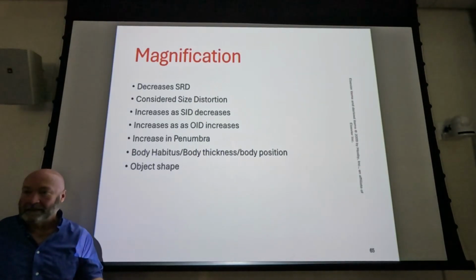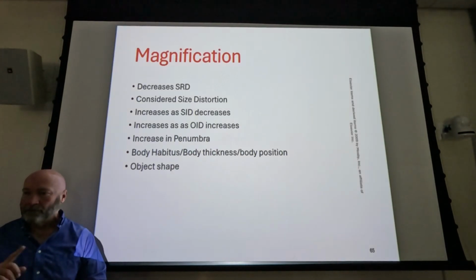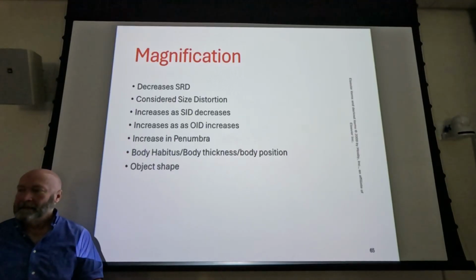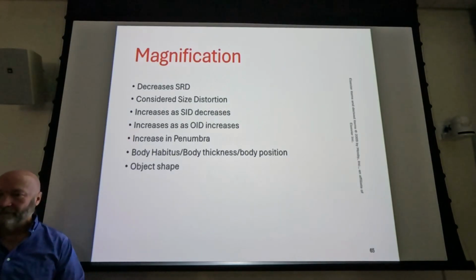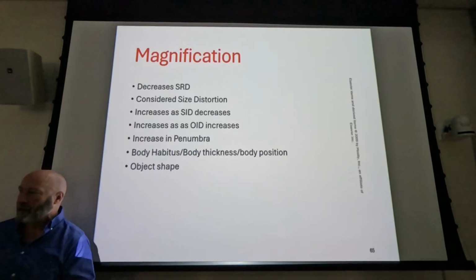That means the kidneys being 1/3 of the way through, if we wanted to get a tomo image of the kidneys, where would I set my fulcrum? 21 divided by 3 would be 7 centimeters, right? So we'd set it at 7 centimeters.